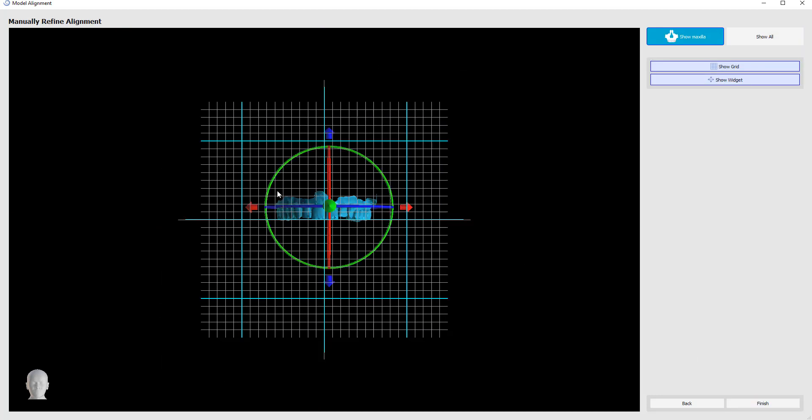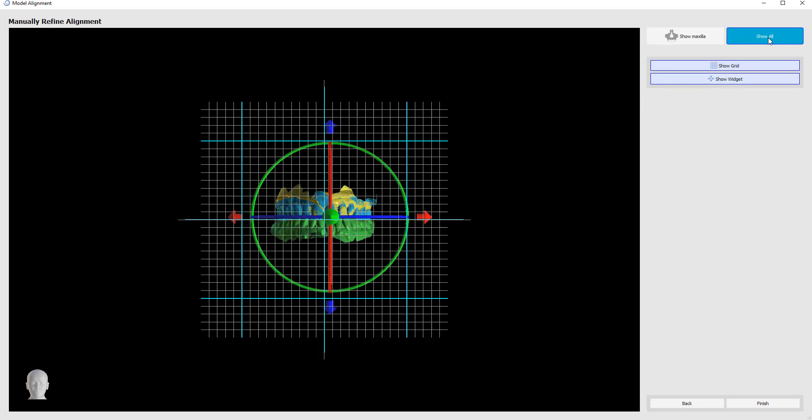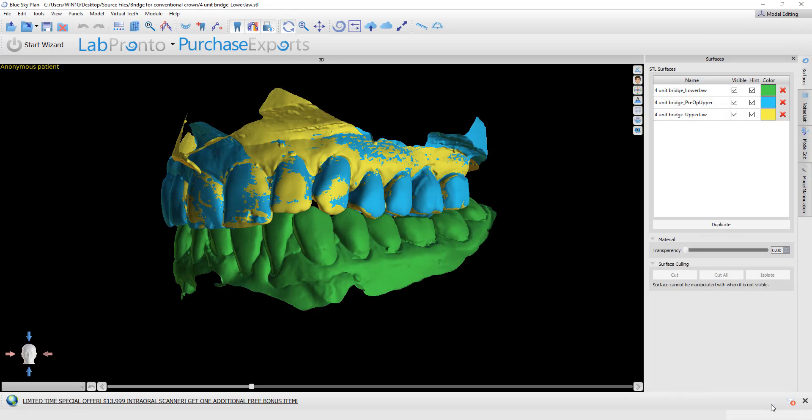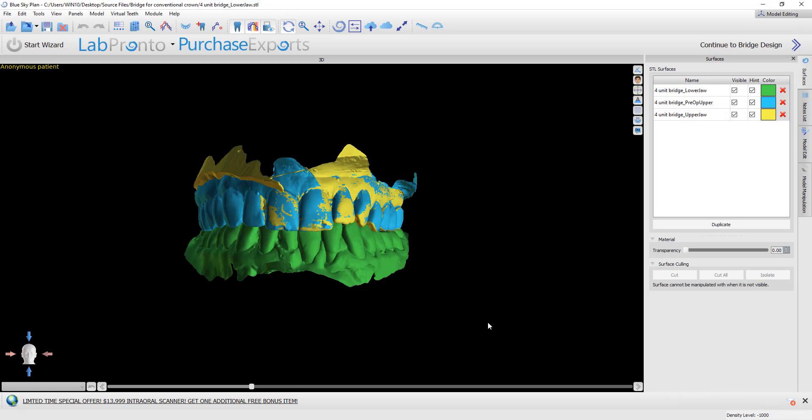We can now fine-tune the alignment by using the widget to move or rotate. We have the option of showing all the models and not just the one particular model, and then click finish. The models are now imported and properly aligned in the Blue Sky Plan software.